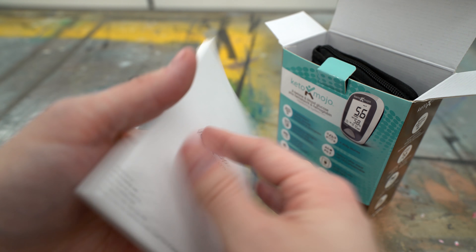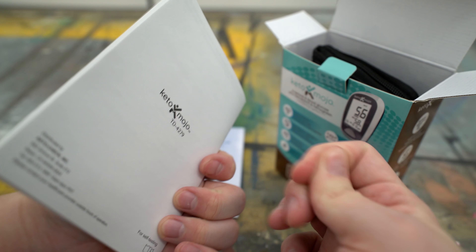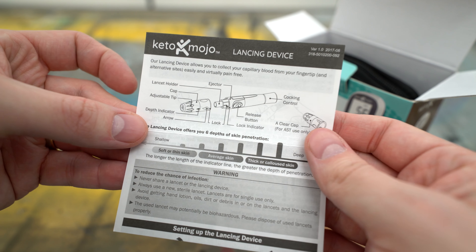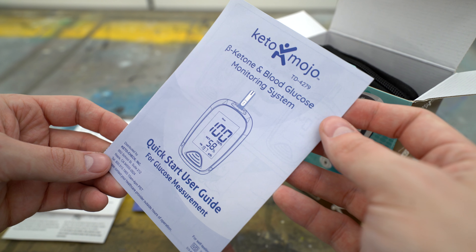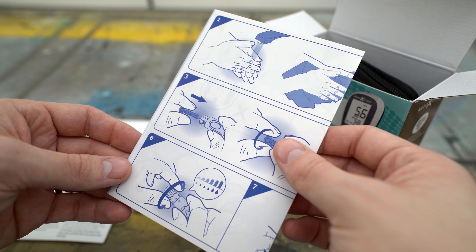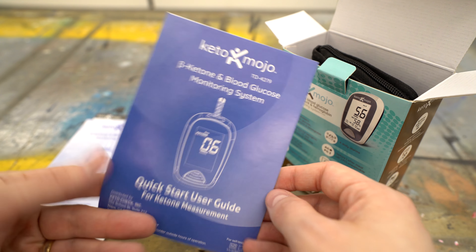Next thing it came with was the manual — just a full manual teaching you all the different things about the device itself, so you can get a good idea of how to use it. They also had quick start guides, and the quick start guides are really nice, just to get you going with the device and the lancets right away so that you know the core stuff you need in order to use it effectively. They had a quick start guide for both the ketone and glucose monitoring, so you can read about each one — a quick start guide was included for each.